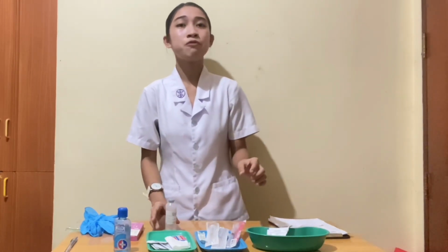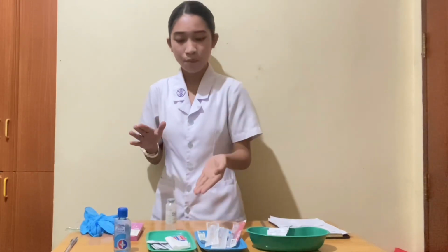Before withdrawing from the vial, remove this needle and attach the aspirating needle, the filter needle, and make sure that the needle is firmly attached to the syringe, because using the filter needle or the aspirating needle prevents any solid parts from being drawn up through the needle.